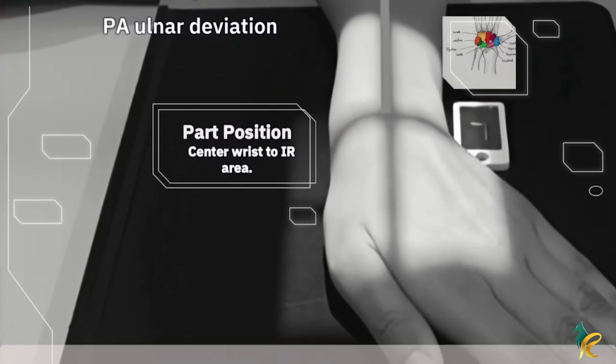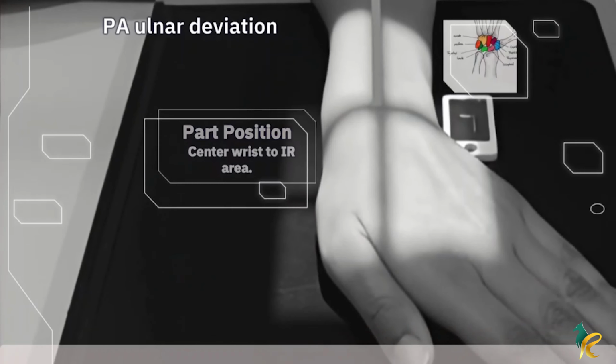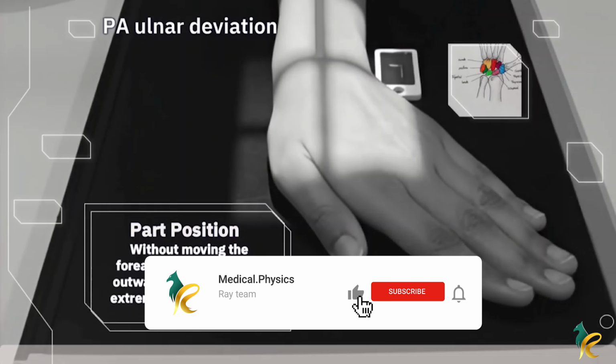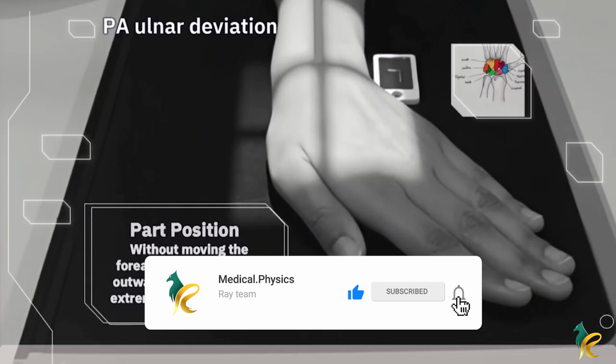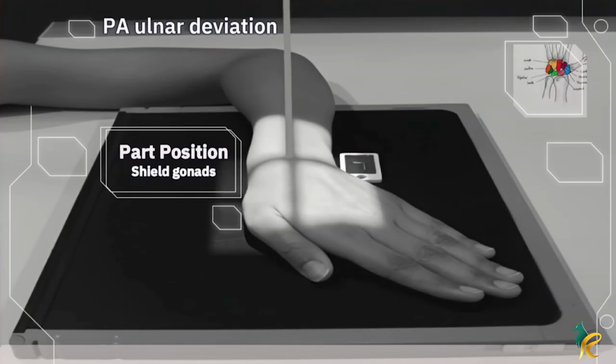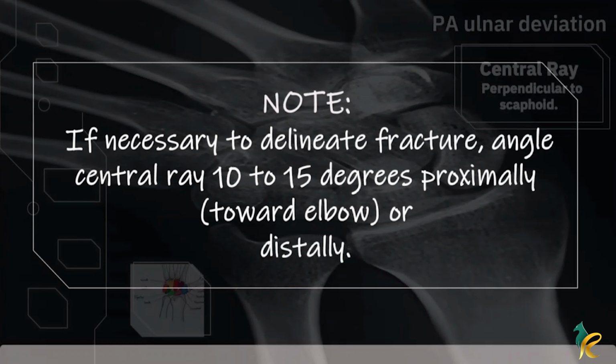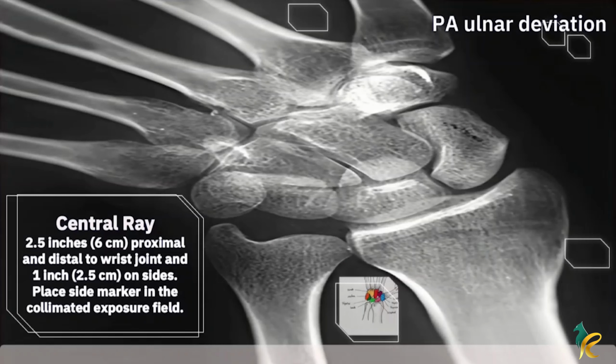They need to turn their hand outwards until their wrist is in extreme ulnar deviation. Our central ray is perpendicular to the scaphoid, but if necessary to delineate any fractures, we would angle the central ray 10 to 15 degrees proximally or distally. The collimator is the same as any other wrist technique, and our kVp is 66.